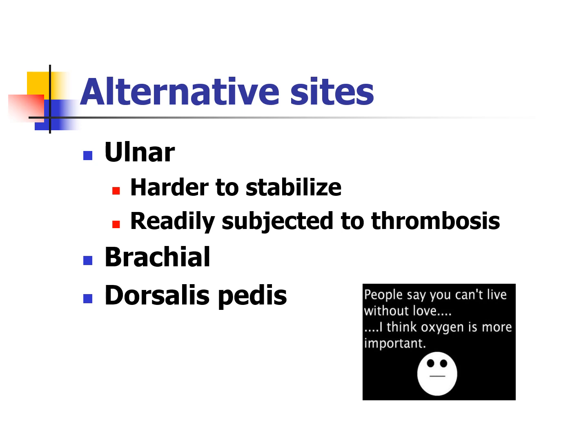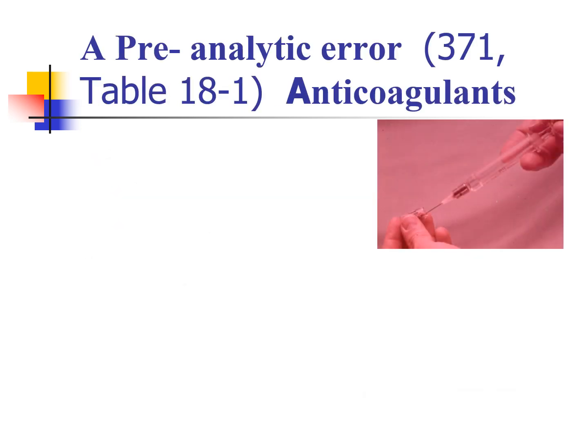This is not something I approve of greatly out there, so we'll talk more about that later. But for now, if you're out there, I would say that's not high on your list of options. Femoral location, of course, during a code or rapid response, is something that usually is done either by the doctor or a highly trained RT. So femorals, hopefully you guys get to see that. Of course, you have YouTube yourself, you can look at that as well.